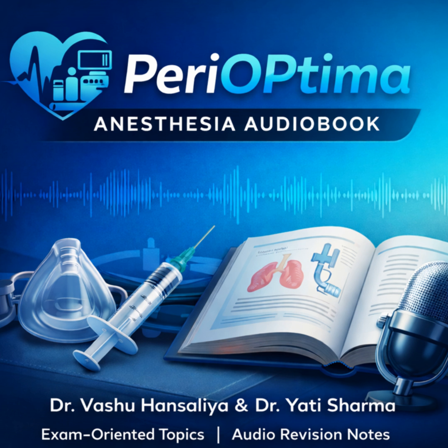How do you do that? Ideally by using manometry, rather than just relying on the subjective feel of the pilot balloon. This practice drastically reduces adverse events. And sustained high pressure can lead to something more serious, like nerve injury. Correct. We occasionally see oropharyngeal morbidity, including nerve palsies, associated with high or prolonged cuff pressures. This just reinforces the principle. You must measure and maintain pressure vigilantly throughout the case.